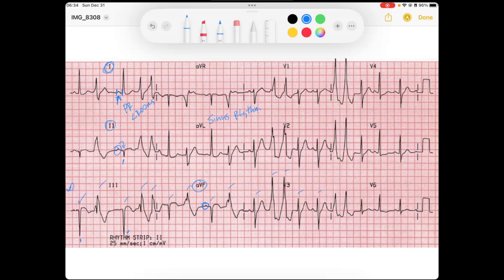Now let's take a look at our QRS axis. The QRS is upright in lead one and down in aVF, which means it is going up to the left — so we've got some leftward deviation.